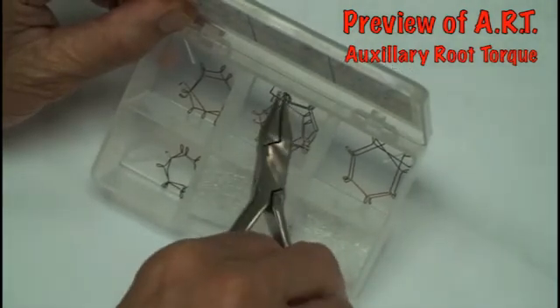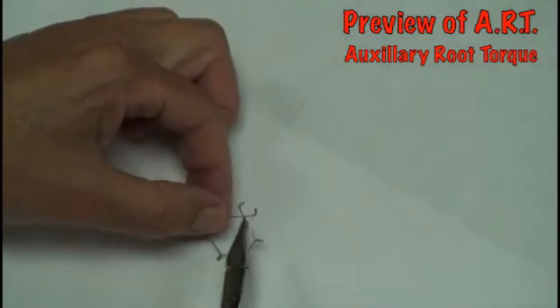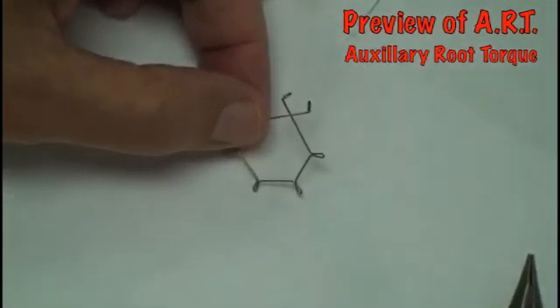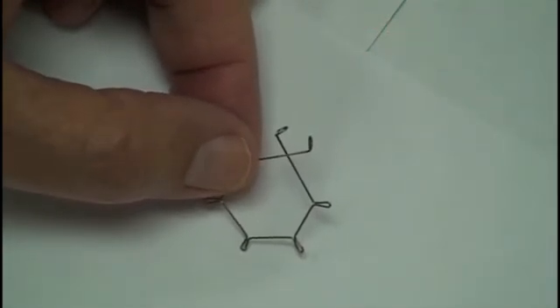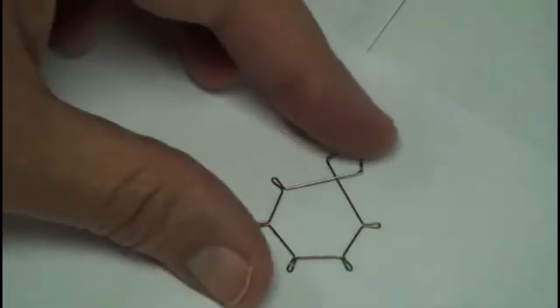If you select a medium sized torquing spring, it'll look like this. And if the dentition is average in size, you can be relatively sure that an average sized spring will fit.